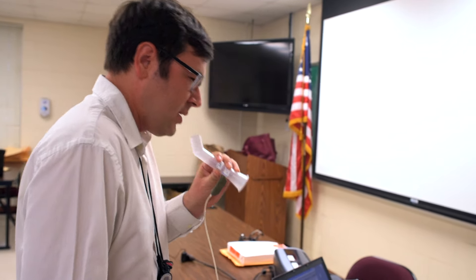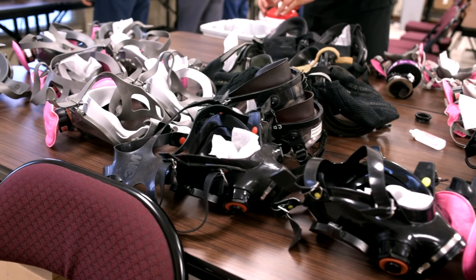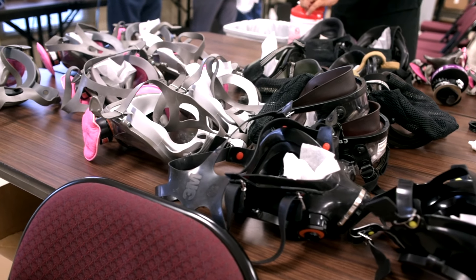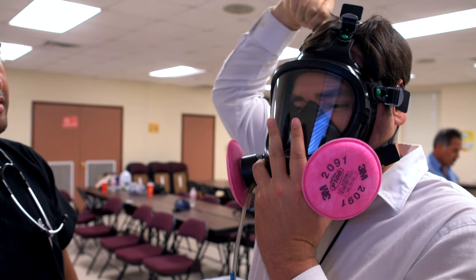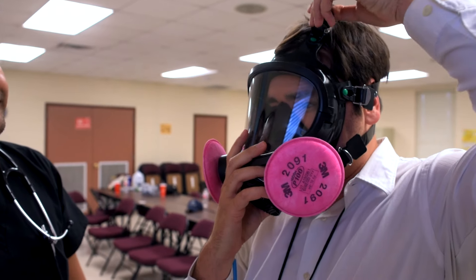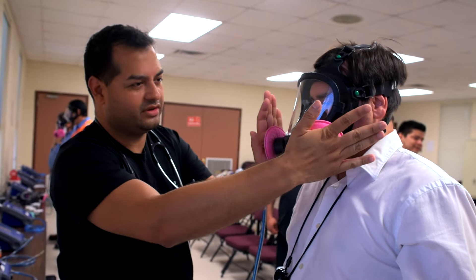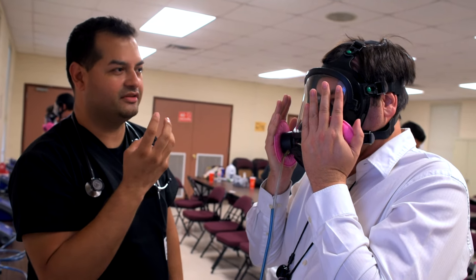There are a number of different types of respirators, and employees must test for each one that might be used on the job. Once the correct respirator has been chosen, the employee puts it on and performs a preliminary user seal check to see if the respirator is properly seated to the face or needs to be adjusted. The respirator is then connected to a machine through a hose.